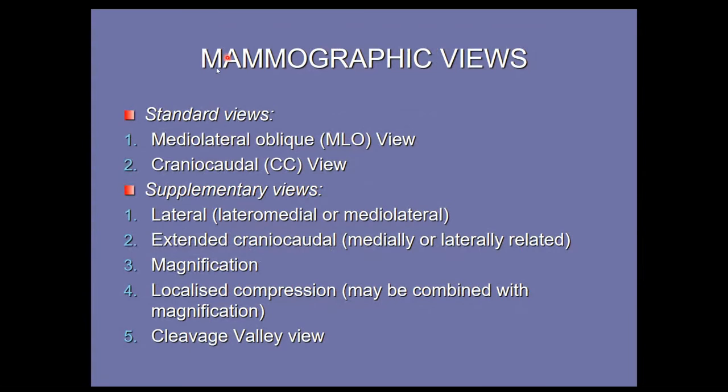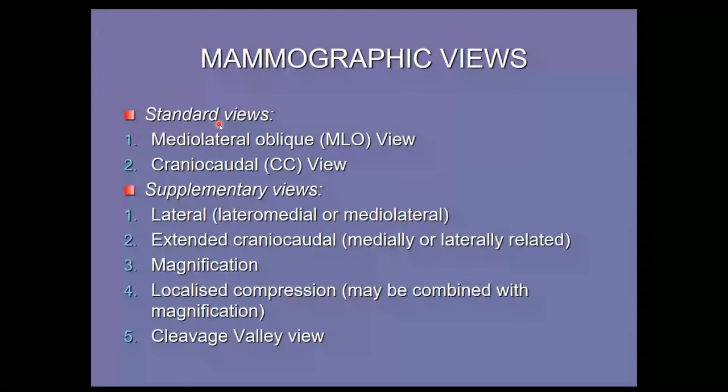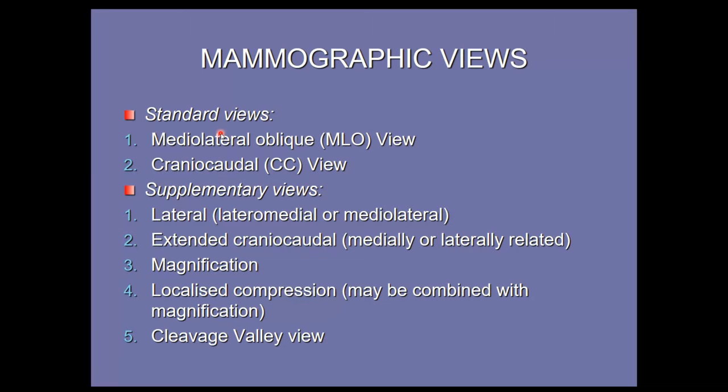Okay, so there are different views. Just like in chest, we perform some standard views, and there are some supplementary ones. What do we mean by standard views? Just like in chest, we perform chest X-ray, posterior anterior view. All of you remember, PA means the projection of the X-ray beam. The X-ray beam is coming from the back of the patient. That's why we are saying posterior, and the X-ray film is anterior. So the X-ray beam is projecting from posterior to anterior. That's why it is called chest X-ray PA.